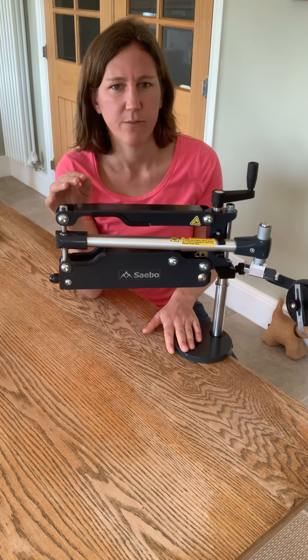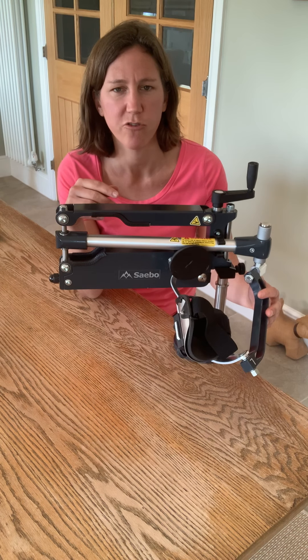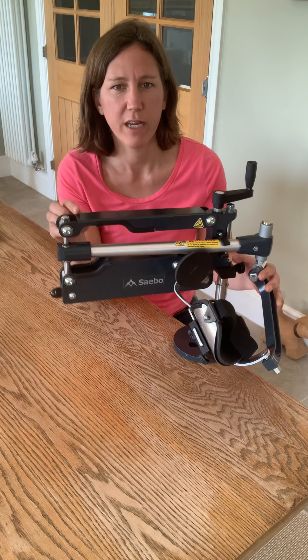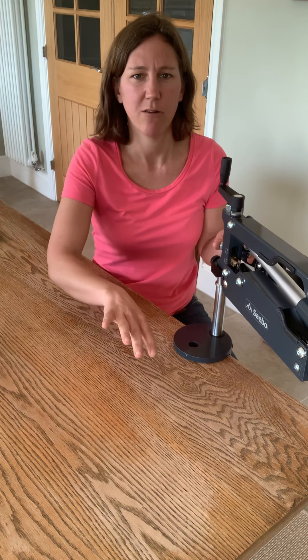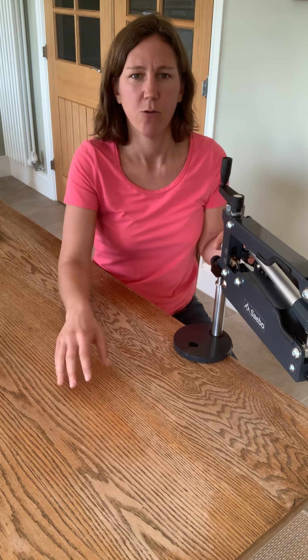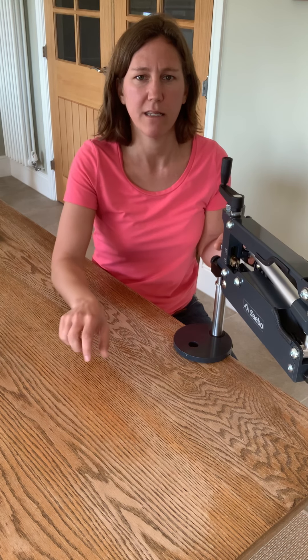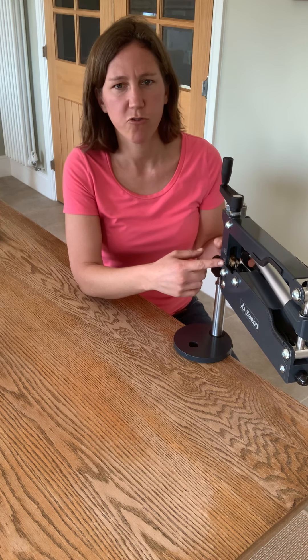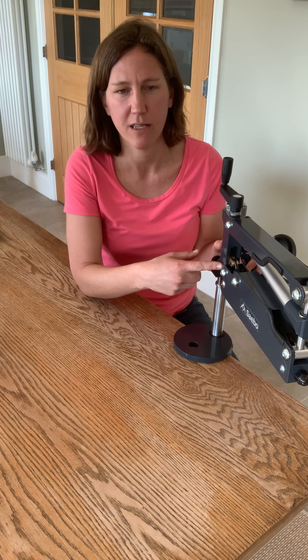I have already clamped this to my tabletop and attached the optional extra supination/pronation attachment, which in essence just means that it allows you the freedom of movement to turn the palm up and the palm down. This is all important if we're practicing hand-to-mouth and manipulating objects. We do have a separate training link that takes you through step by step exactly how to attach that.